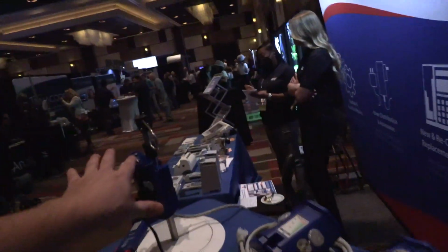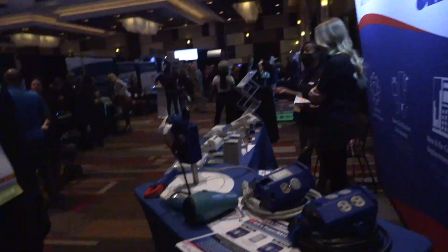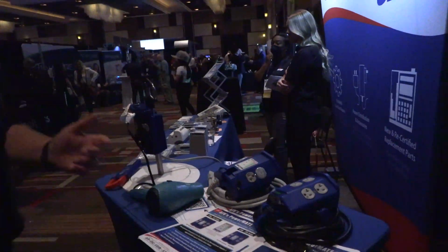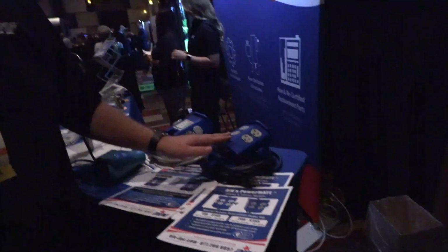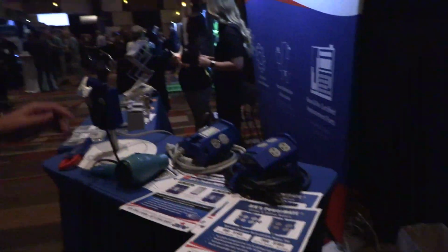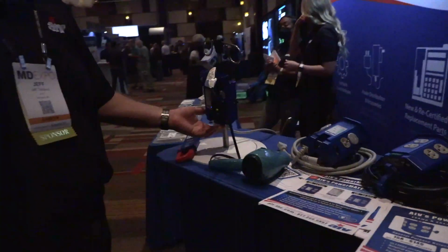In all honesty, in my ORs, if I was still in ORs, I would want those ones, because staff is staff. They do staff-like things. With this having a graphical representation of the load, it tells them when they're getting a little out of hand. And while it was convenient to have 6 plugs on it, we found that staff was abusive and would quickly overload it by plugging in things they didn't need to. So we went back to the 2-plug and had to modify the case a little to run the dual breaker system.